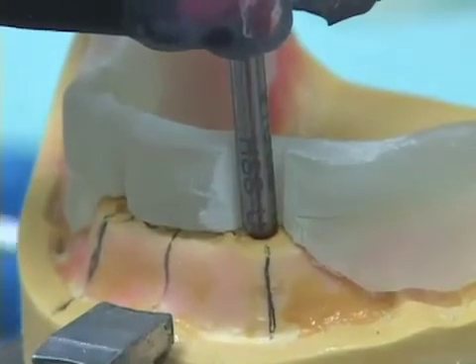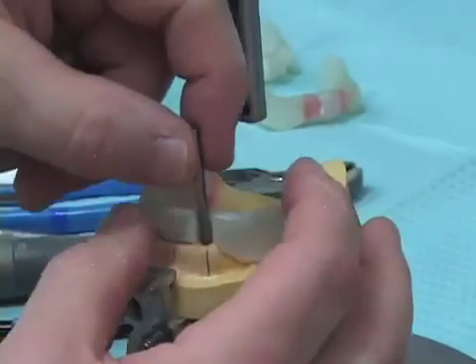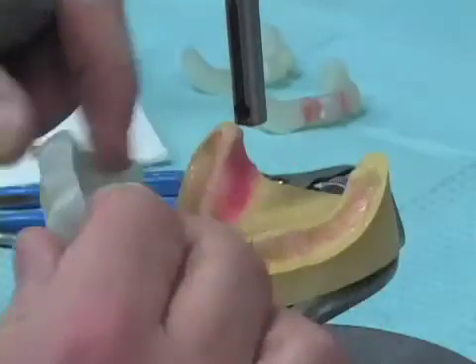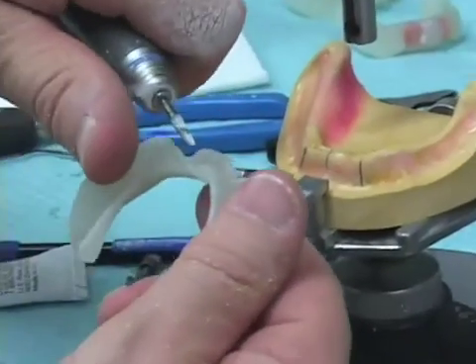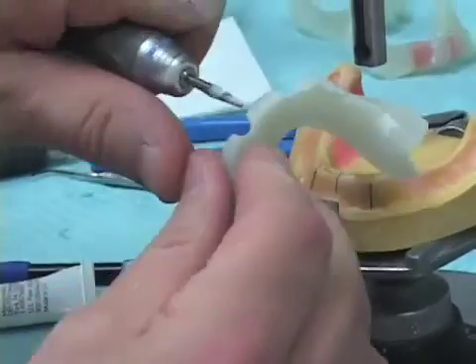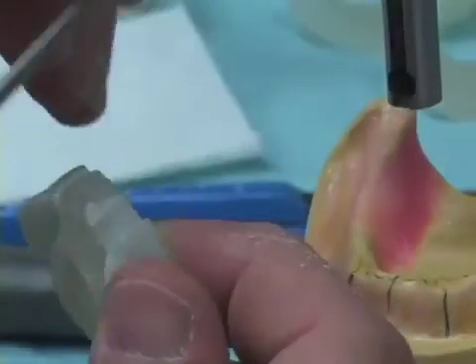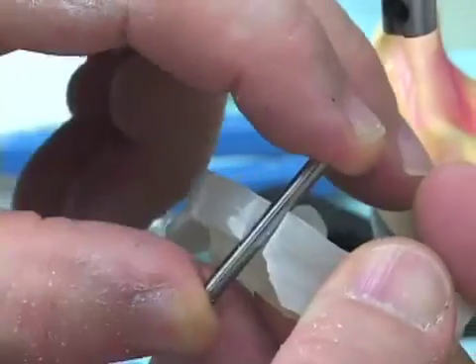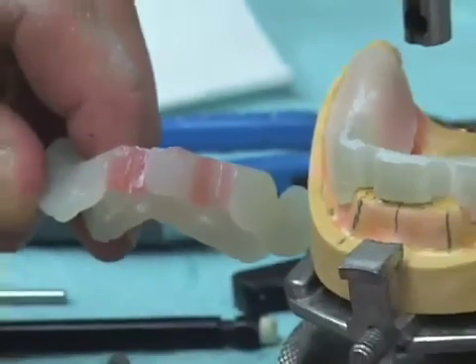When both sides are cured, you can just release the clamp, and that will let the drill blank come away. We remove the drill blank, and then taking our acrylic burr, we go ahead and trim it on the occlusal, trim it on the tissue side, and then come in and trim it so that our 3.5 millimeter drill blank can fit in and out very nicely from the buccal, but there's no lateral wiggling. So that completes the making of the surgical guides for the 2 implant overdenture.